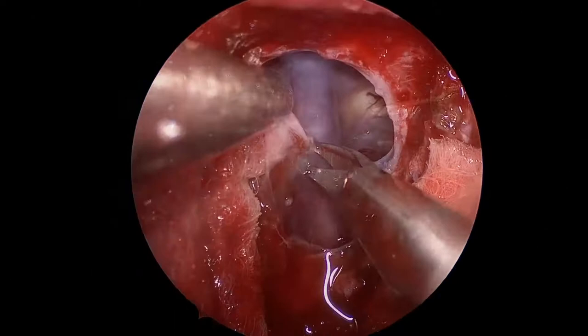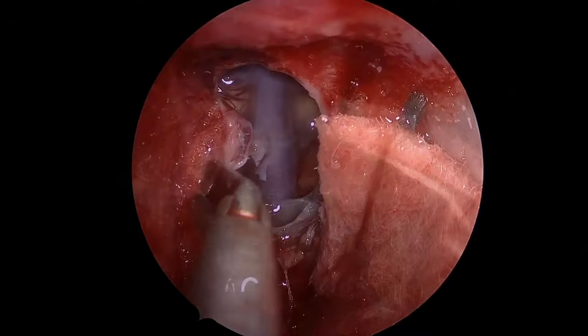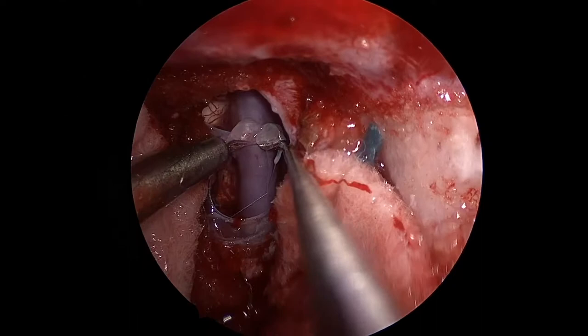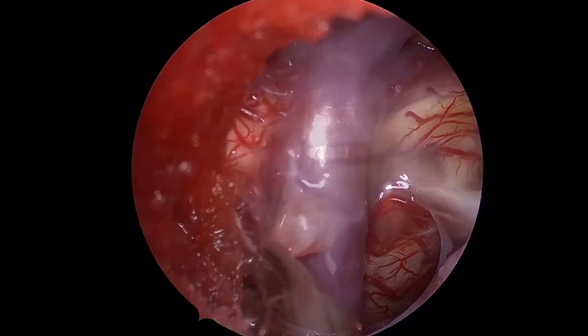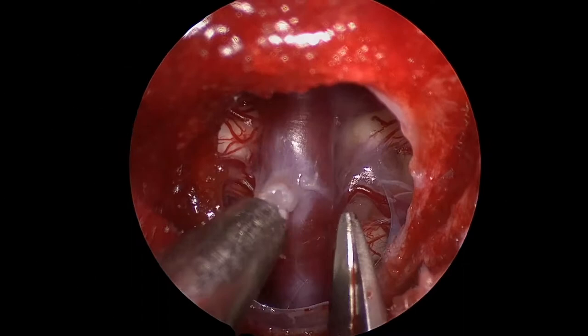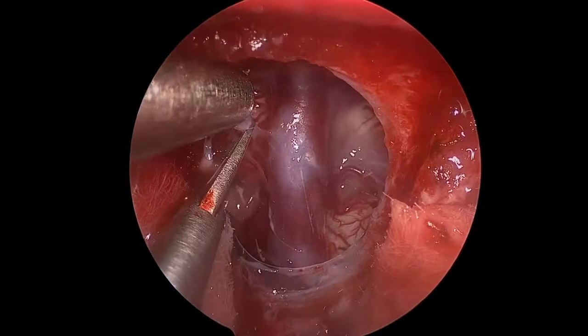Unfortunately, because of the previous operation, there are significant adhesions between the dura, the arachnoid, and the basilar artery, and this requires very careful meticulous dissection to prevent a vascular injury. We are finally able to remove all this dura and separate it safely from the basilar artery. There is a small remnant of tissue that is very adherent to the wall of the basilar artery, which requires again very careful meticulous technique to achieve a complete resection without causing any vascular injury. This is done with sharp dissection mostly, avoiding pulling that could injure the basilar artery.